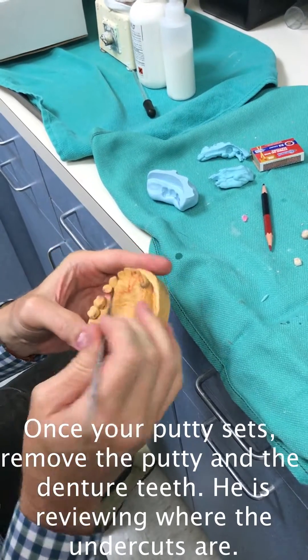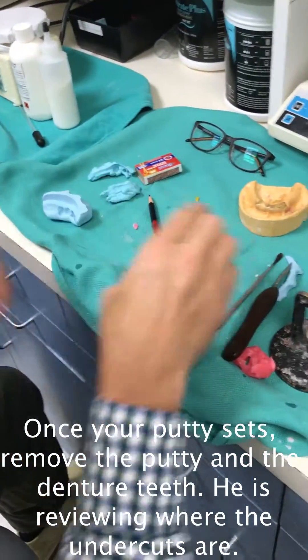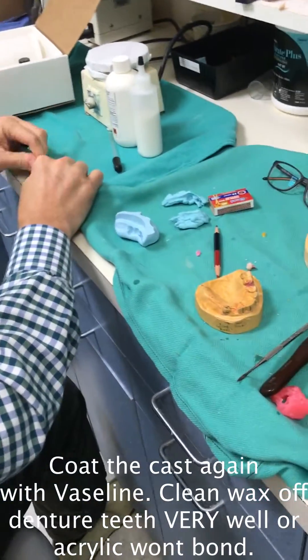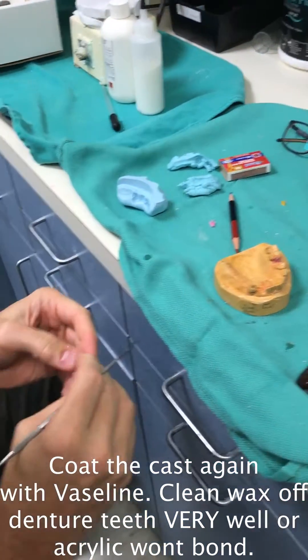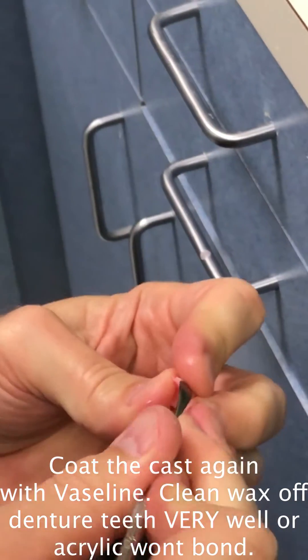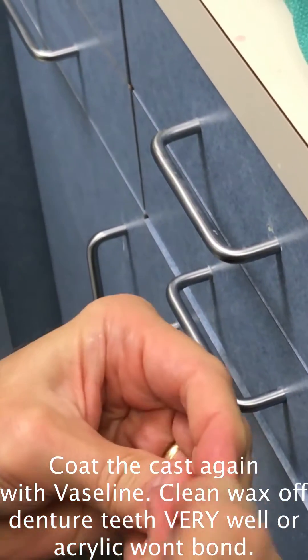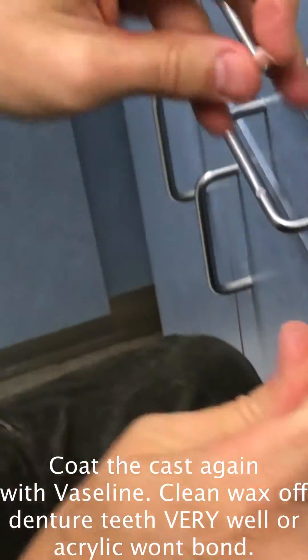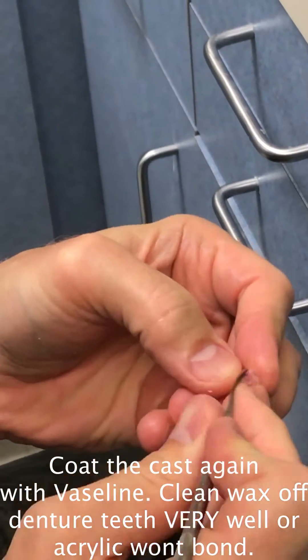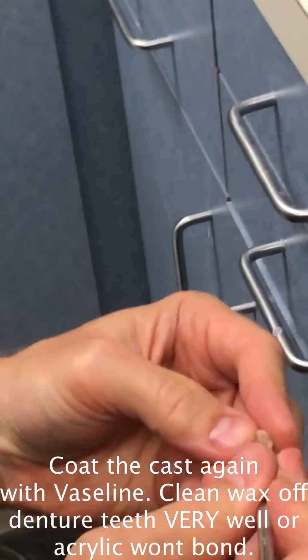Be aware of areas of concern — a little undercut there — so when you try this in, you may not relieve it enough to get that undercut out. You may have a little undercut here or there. Then you need to clean your teeth off real well. This is exactly what the technician does when they do a denture — they have to clean the wax off. And if it's a single tooth and a very simple appliance, I just fit it in and crazy glue it to that tooth instead of making an index.